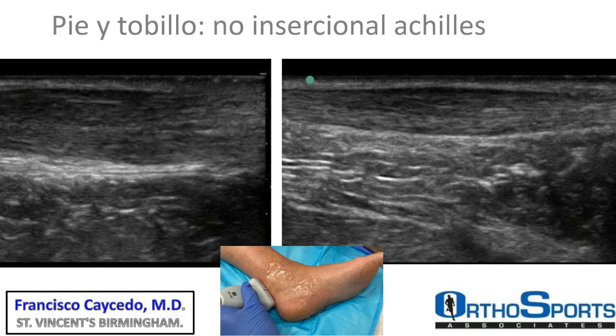And here you can see very clearly. When you palpate it and you can still see it, the patient jumps, it is very painful. So you always have the correlation, and that's the beauty for the clinicians, where you can see, you can feel, and you can show the patient. So this is a very good instrument for all the orthopedic surgeons and clinicians.